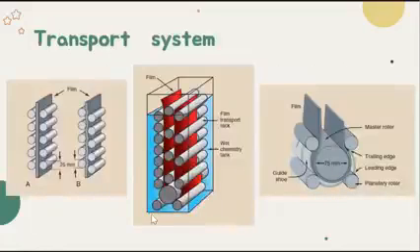And then at the bottom, we have this big one, the solar or the master roller. Okay? So within each processing tank, at the bottom of it, we have what we call a master roller or solar roller, which allows the film to be turned 180 degrees. So after it goes down in this area, the master roller is responsible for it to go back up.